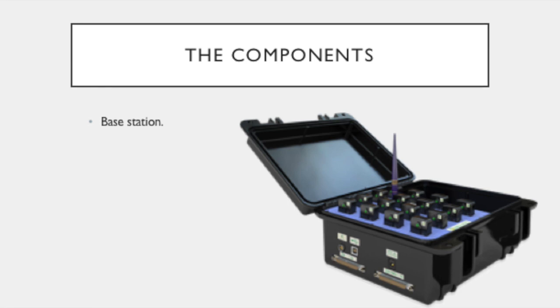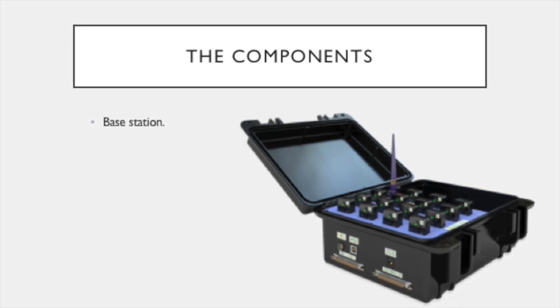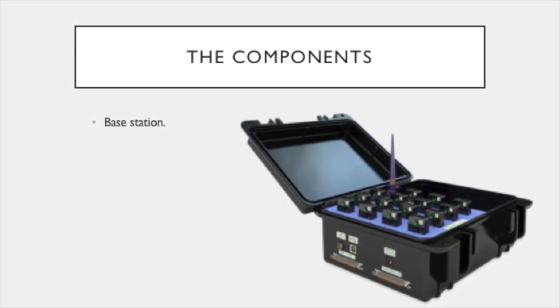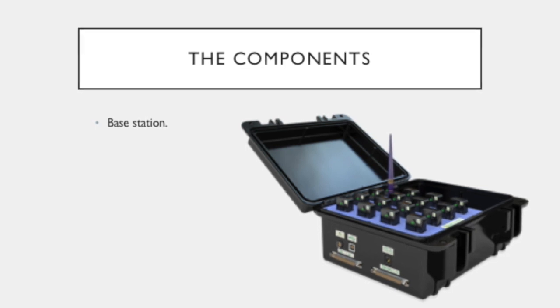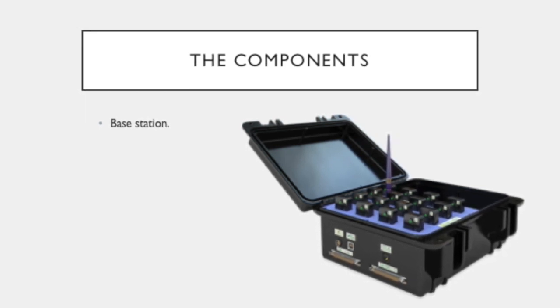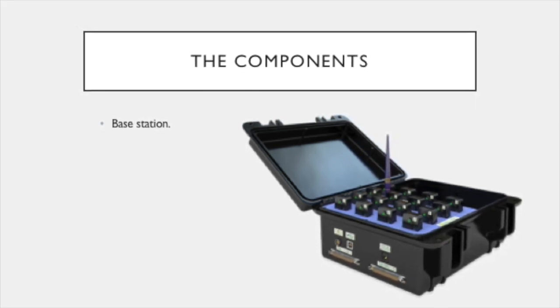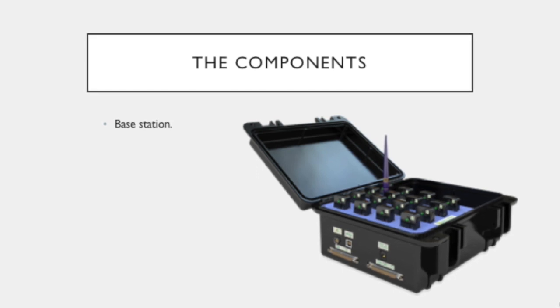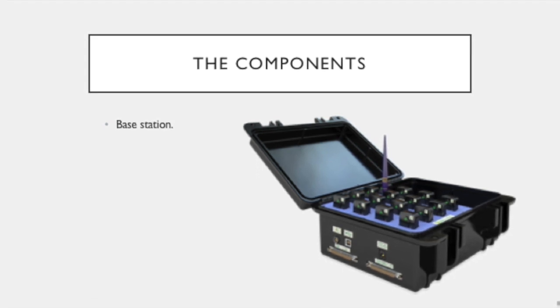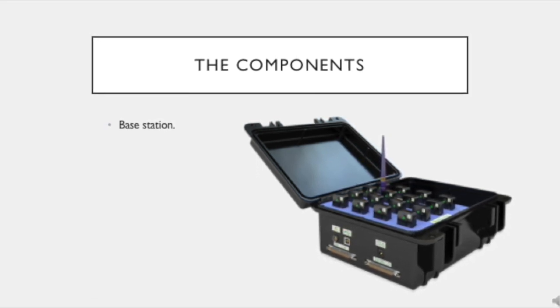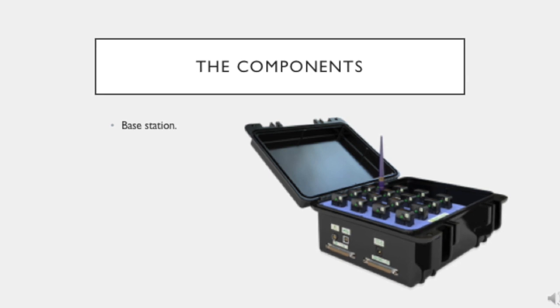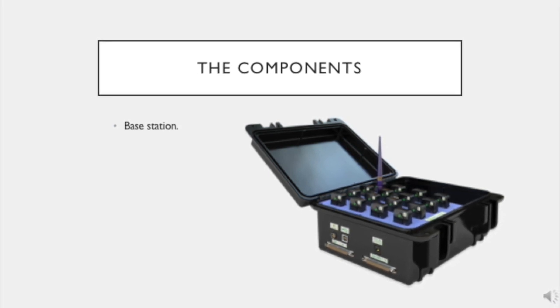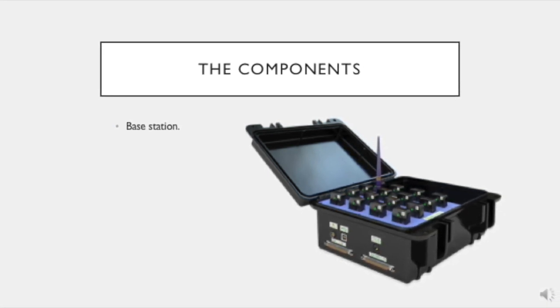The first component is the base station. The base station serves as a hub for the DELSYS Trigno system. It transfers data between the wireless EMG sensors and the computer. Furthermore, it acts as a charging station for the EMG sensors while also serving as a handy carrying case for the DELSYS Trigno system.